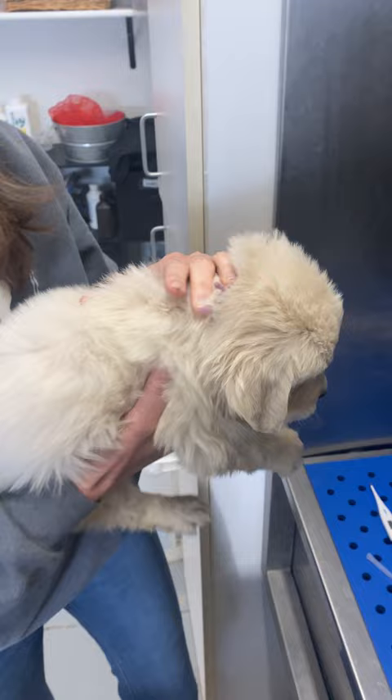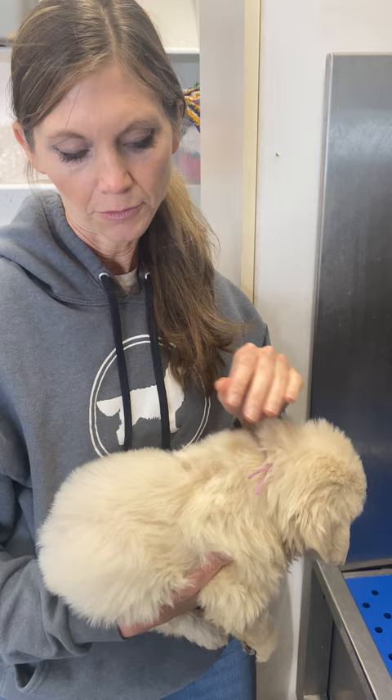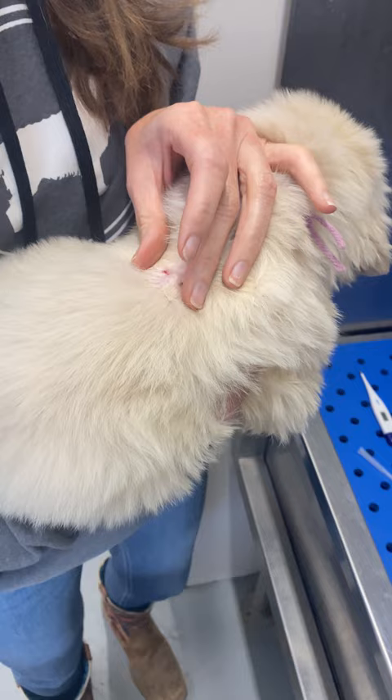And you are done. You'll want to just double check to make sure you didn't go in the skin and push it back out, and then inserted the microchip and it's sitting on top of the hair. You can see a little blood spot right there, that little hole. Sometimes they bleed more than that. I just pinch them closed, and it's clean because we used alcohol, and then you're ready to go.